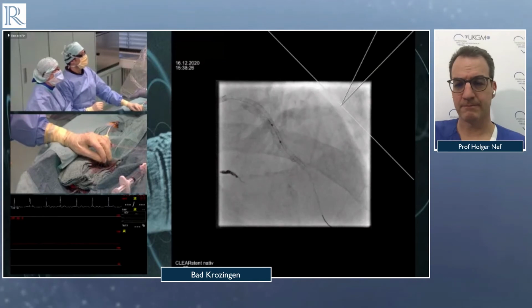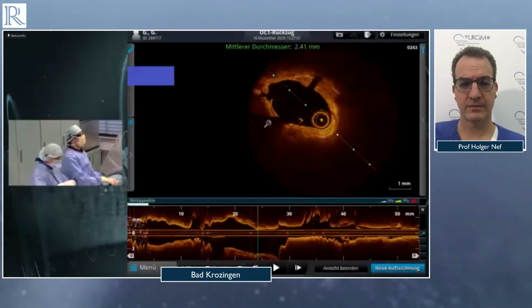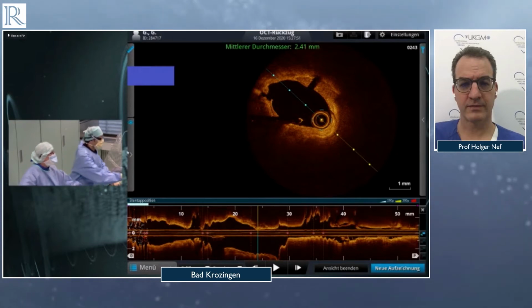What do you think? Yeah, I think we will show you the OCT because we still should have 3 minutes. And if the OCT is okay, we make an angio shot and we're done. And with the case just in time, right?